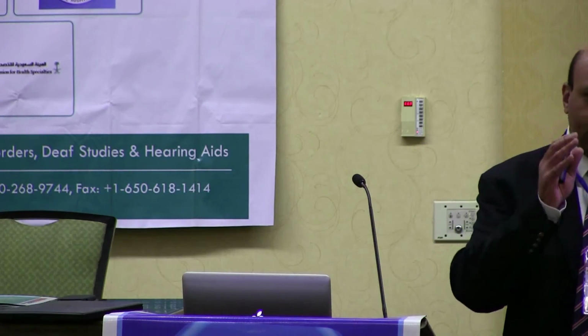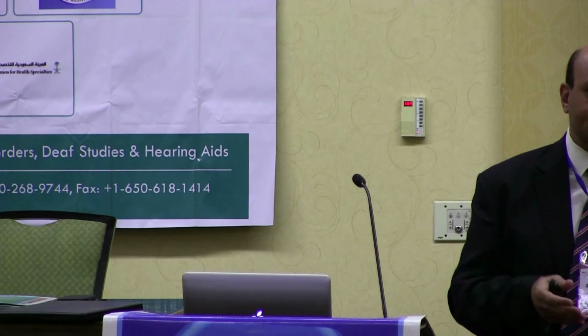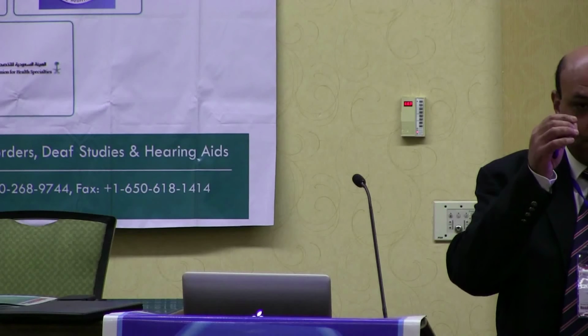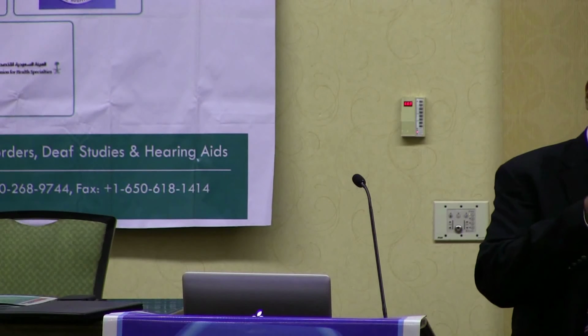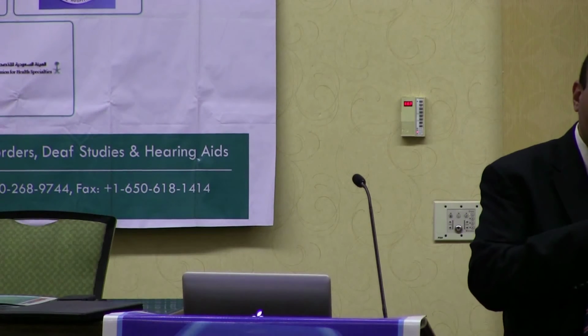Any questions? What do you mean by the four hands? Four hands: if you are doing surgery for the ear using the microscope alone, what's the role of your assistant? Nothing. If you use the endoscope, you use one hand, and the other hand you manipulate, while the assistant can see with another endoscope from the other side, from superior. Both surgeons can work in one case. You understand me? Does he have a role in the insertion of the electrode? No, he just supports the electrode from the mastoid side, and you do the insertion from the middle ear side.